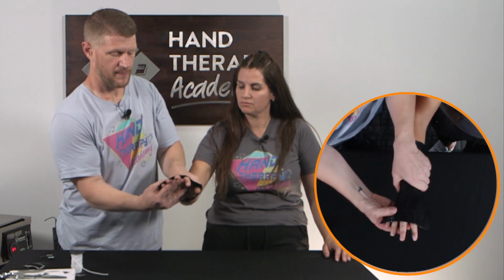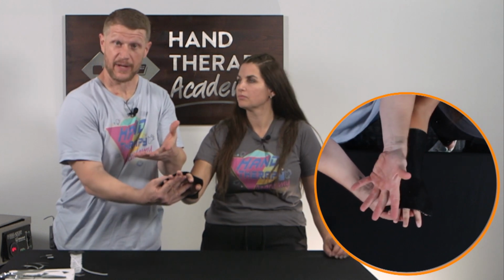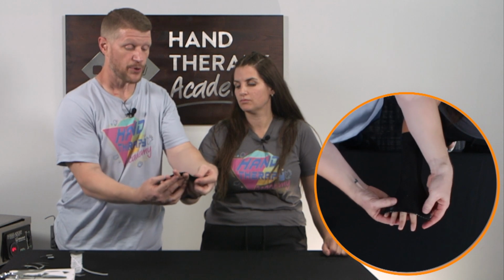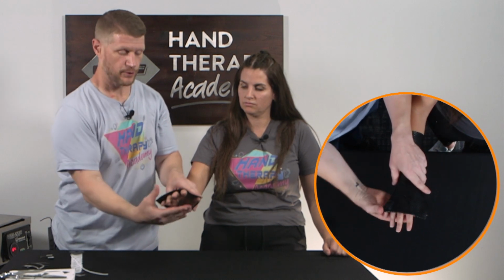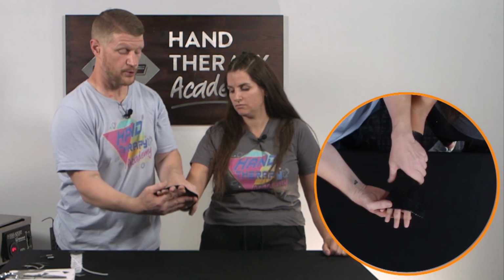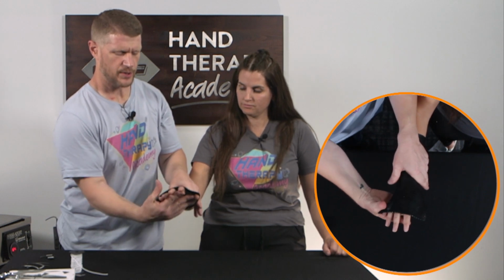Then I'll take the wrist back just a little bit. You can, if it helps with the patient, because they don't have wrist extension to help hold it there, I'll put them on a ball like we would do for ball rolling for a wrist. I'll just put their hand on that, and that kind of mirrors that functional grasp, and then I can rest their forearm on something to help keep that wrist in extension. About 30 degrees of wrist extension.